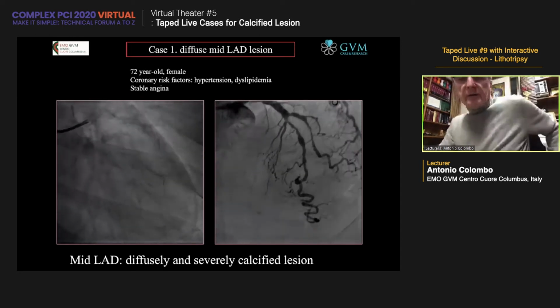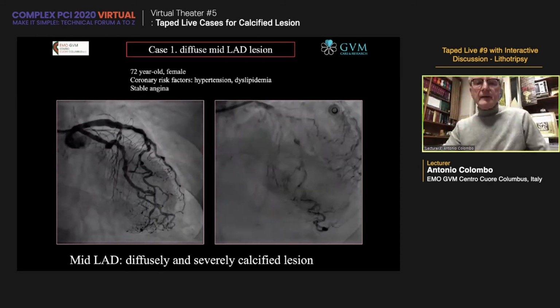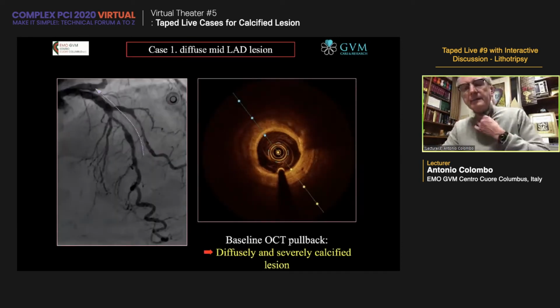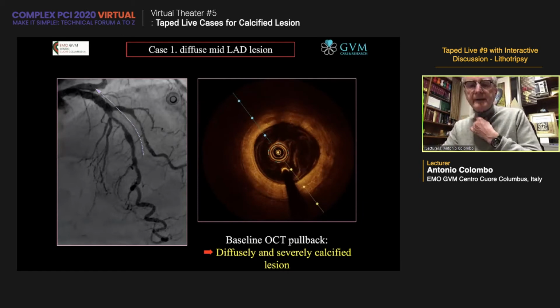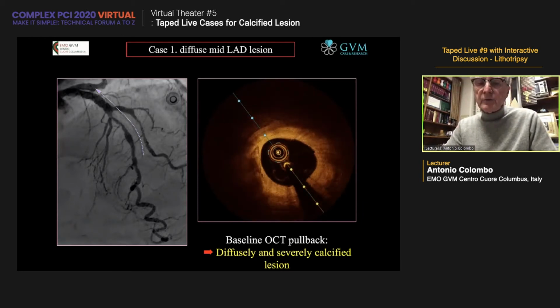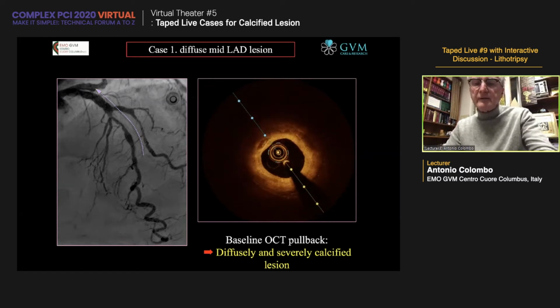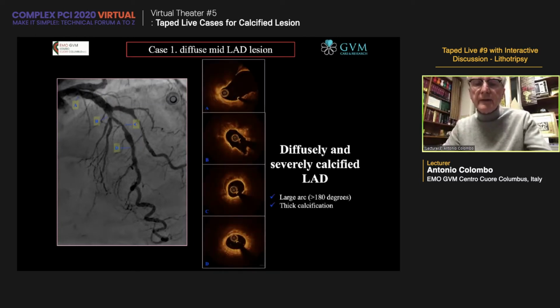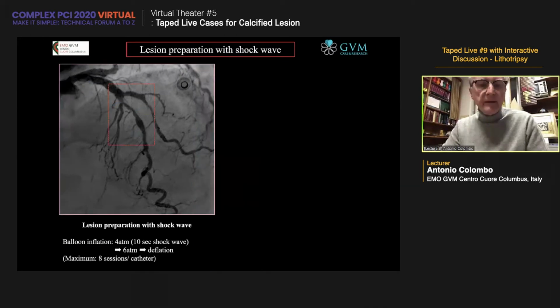So you wonder, why do you really need something new now when it worked pretty well for 20 years? The answer is that we look for better results. The OCT shows pretty bulky calcium, between 9 and 12 o'clock, over the whole area. You see the steel frame; it is pretty dense, especially in C, a big chunk of calcium.